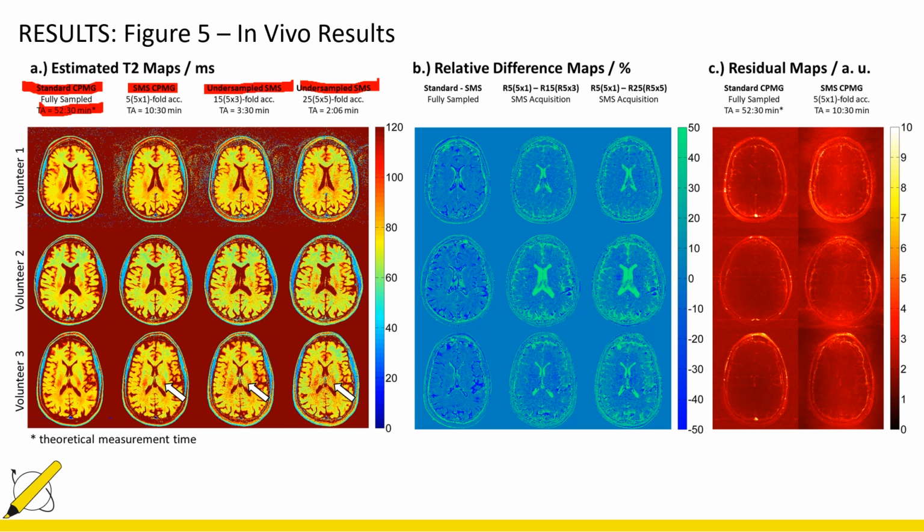Okay, so now I'm checking your figure 5 in your paper where you had the estimated T2 maps and relative difference maps. Can you discuss the reason behind those popping up ventricle CSF regions? So obviously these pop out very clearly, and the thing is we're using 16 echoes, I think with roughly 10 milliseconds echo spacing. We end up at 160, 170 milliseconds as the latest echo. But the T2 of the CSF is way higher, so the T2 value of the CSF is way out of our measurement range. And even a little change in noise or signal amplitude will make a huge impact on the estimation there.